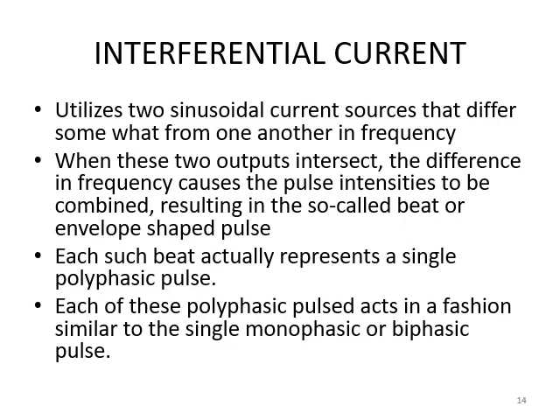These are also known as beats or envelopes, and these beats are produced at a lower frequency, again within the range of 1 to 120 Hz, which can be determined by the difference of the original two intensities and their frequencies. So this interference producing the beats will actually produce the low frequency beat current, and that is useful for stimulation of peripheral nerves.